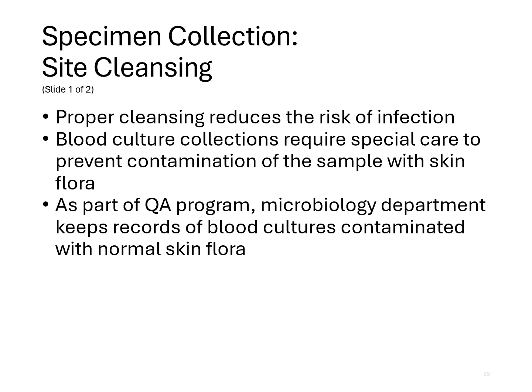And then as part of that QA program, the microbiology department keeps records of blood cultures that have been contaminated with normal skin flora. And a lot of times this is going to be a training type of thing. So if we notice that we get a lot of normal skin flora contaminants and it's all by the same phlebotomist, then we can actually do some training with that person and try to prevent it from happening again.